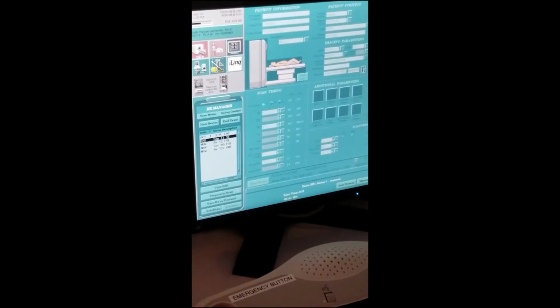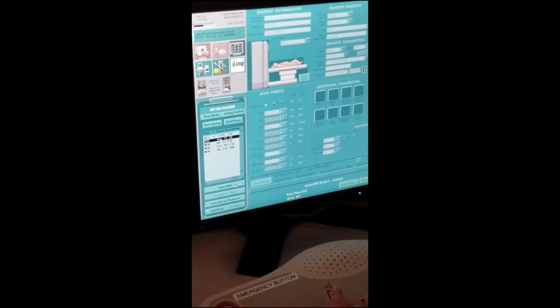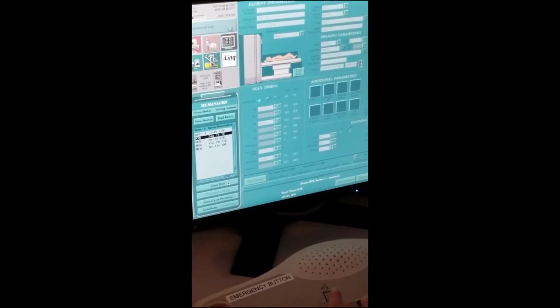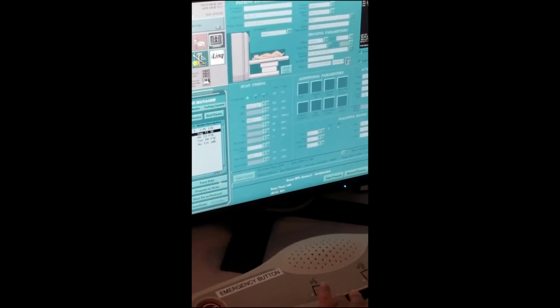Okay, so save the series. If I wanted to go down to 400 and got 23 slices, that's too low. You're gonna start hearing noise. Just for example, if I wanted to get one slice, it'll be a little under 2 minutes.